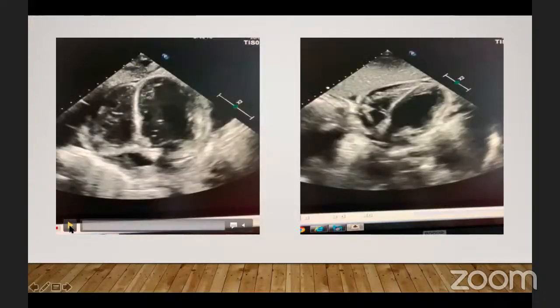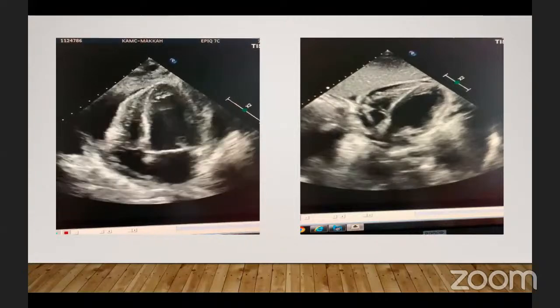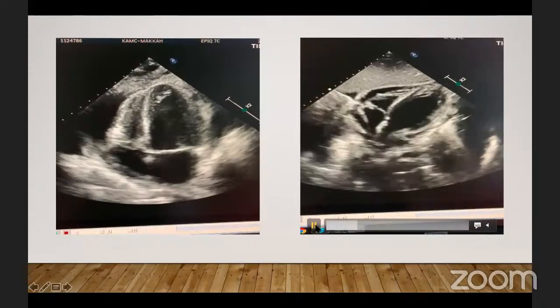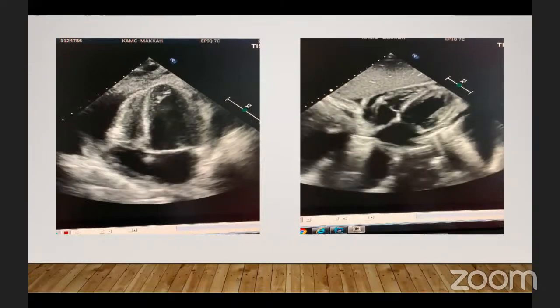This is a small video of one patient we had a couple of months ago. You can notice how the heart is swirling. This patient wasn't in tamponade, though. This looked like severe cardiac tamponade, but you can see there is only mild diastolic collapse in the RV, especially in the distal part of the RV, with a large effusion.